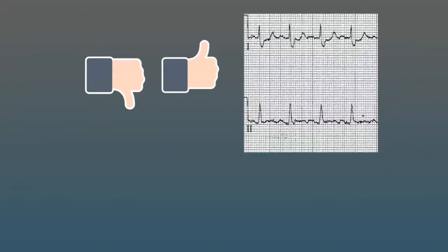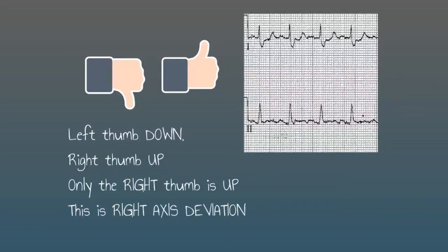In this ECG we look at lead one and there's an S wave that's at least as deep as the R wave - it's borderline really. But let's say for the sake of argument that this S wave is a little bit deeper than the R wave is tall. We're going to put our left thumb down, and then we look at lead two and notice that it's predominantly upwards - there's just an R wave so we're going to put that thumb up. Now there's an axis deviation here because one thumb is down and one is up, and it goes in the direction of the thumb that remains up. So your right thumb is up and that means it's right axis deviation in this case.